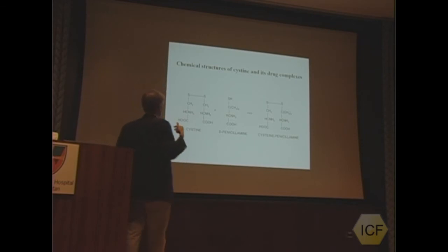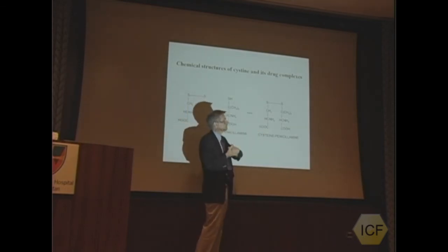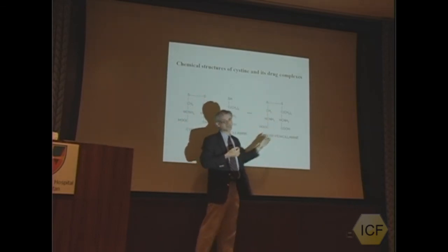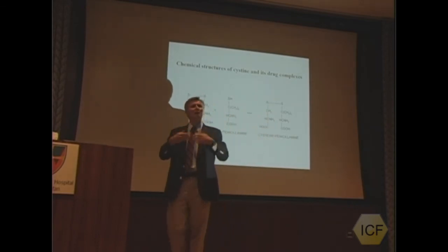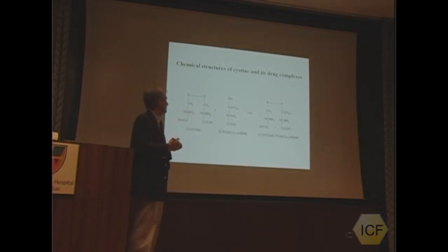Even some of the HPLC methods don't necessarily account for how much of this complex is formed. Many of the HPLC measurements, when they want to measure cystine, break all these sulfur bonds. And so you can never know how much cystine was excreted with drug. So it's often very hard to measure these things. Next slide.